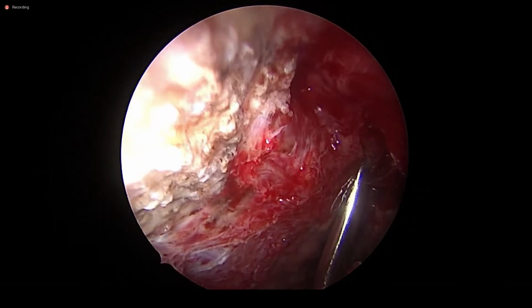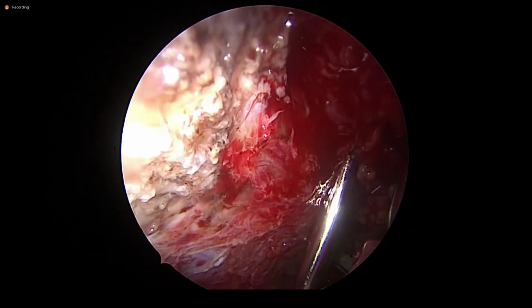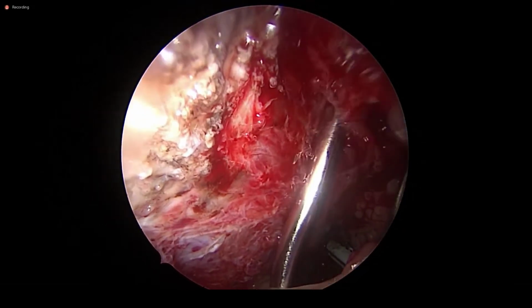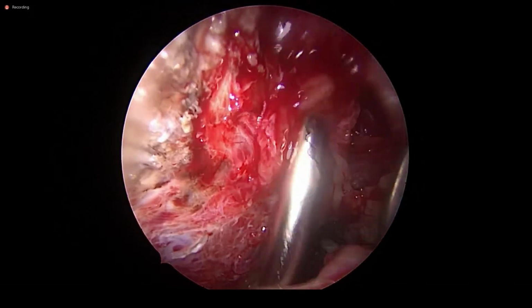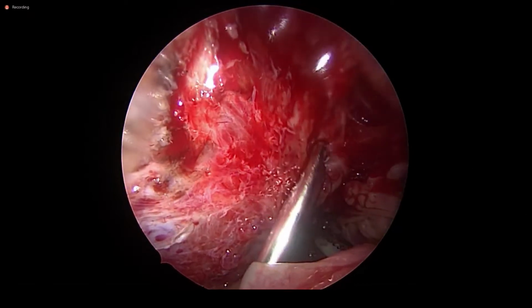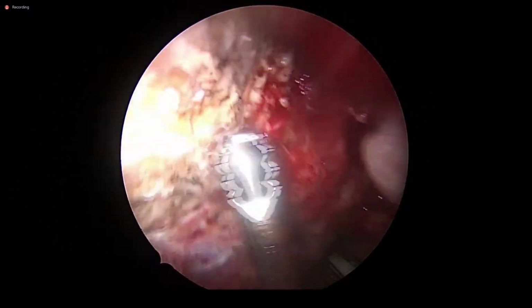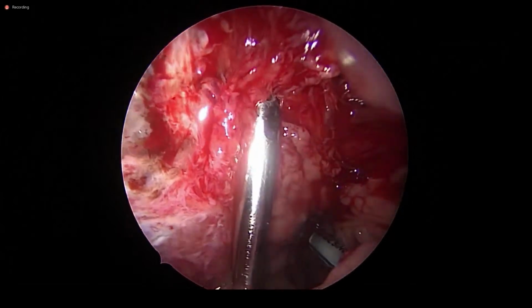Sir, are you working in the fossa of Rosenmuller, sir? This is responsible for the persistent problem if not taken care of. See this? This is the fossa of Rosenmuller area. The fossa of Rosenmuller is still far deeper. Thank you, sir. See, it is completely cleaned off. Can you see? See the musculature laterally. See, this is the lateral musculature. Can you see?